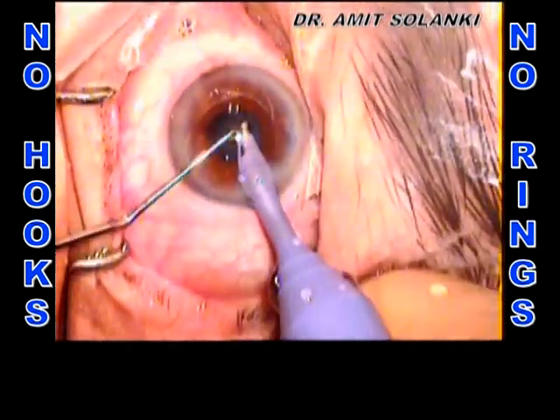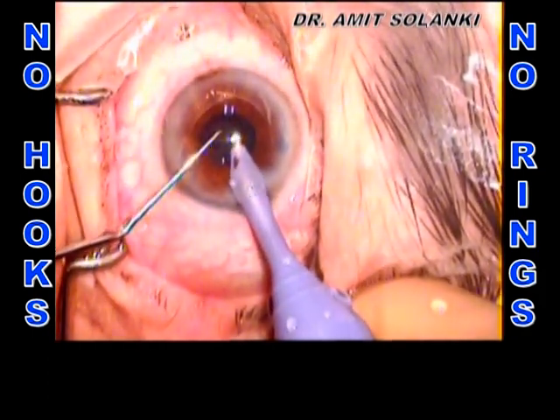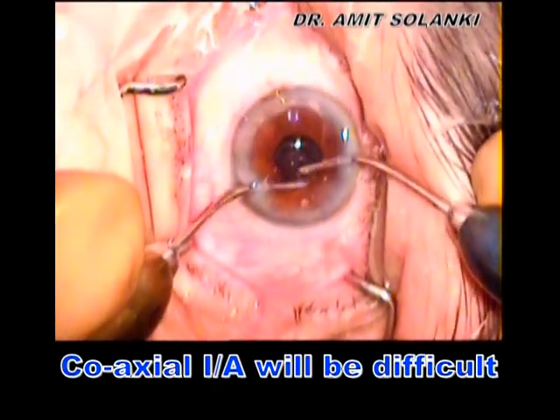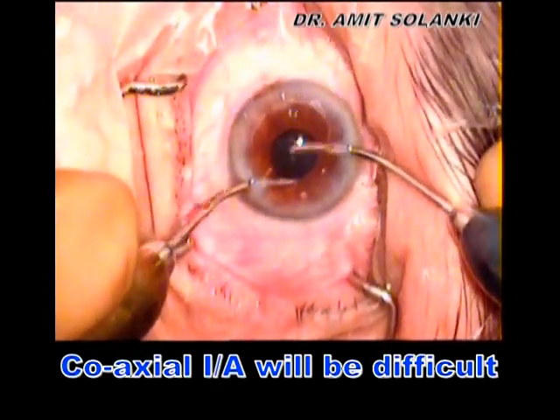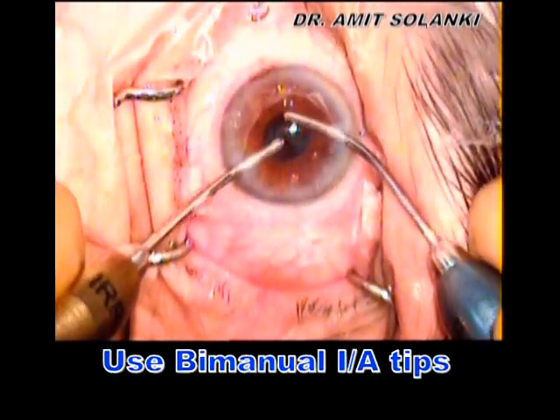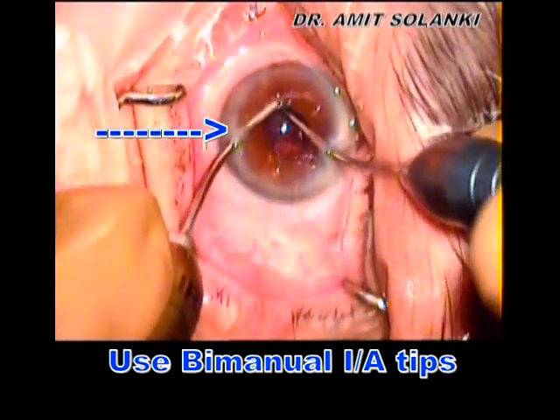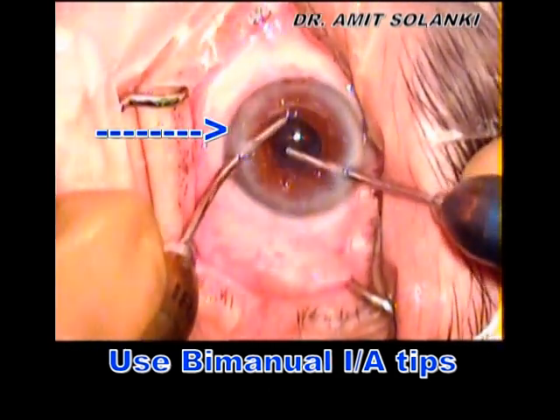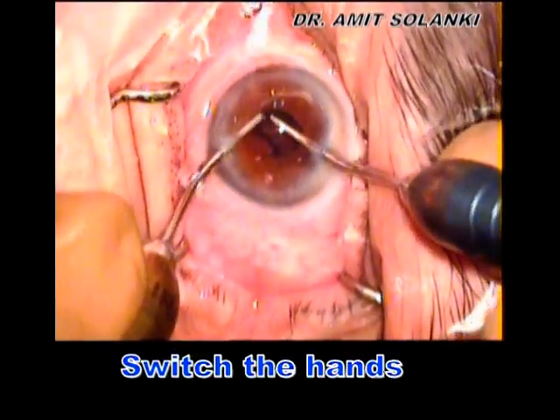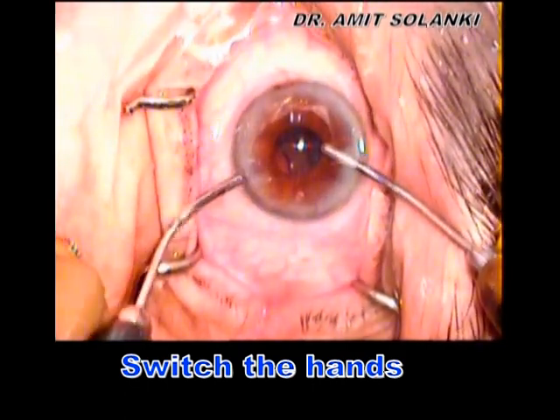The epinucleus can then be aspirated with the phaco tip. For irrigation-aspiration, accessing the full 360-degree cortex in a small pupil with a traditional coaxial IA tip is really challenging. I prefer bimanual IA, where you can actually lift the iris with the irrigation tip and cortex can be aspirated easily. In addition, you can also switch hands, which gives better access to the full 360-degree cortex.